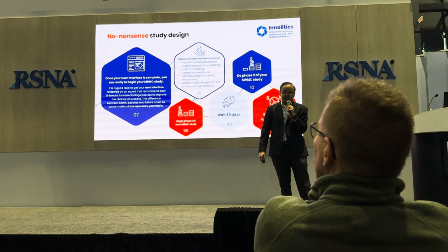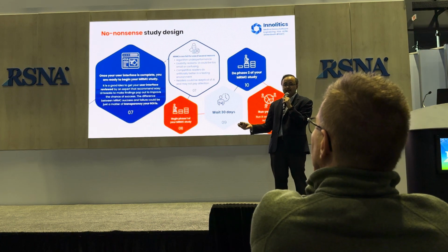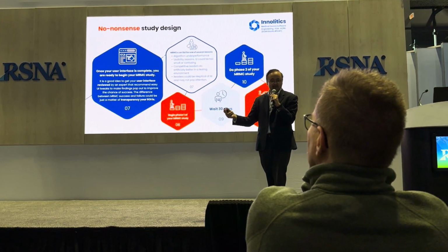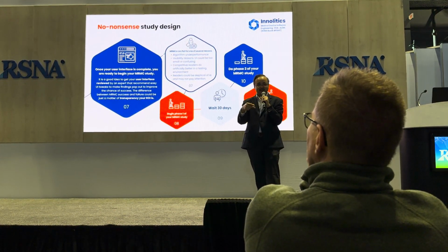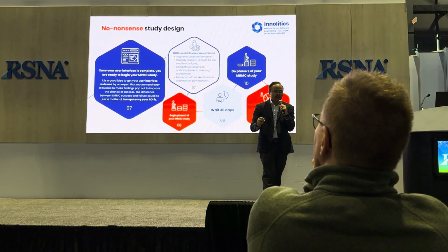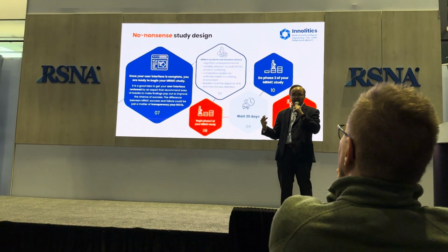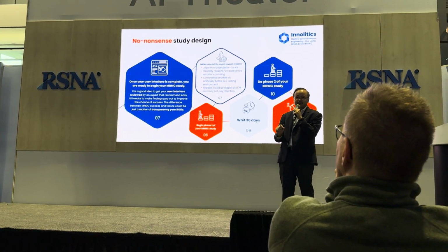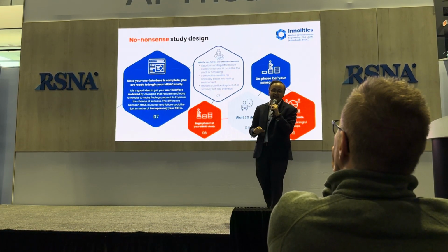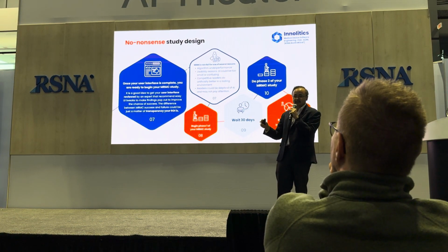A multi-reader study could fail for one of several reasons. The first reason: your algorithm just might not perform that well. If you did your standalone performance testing first, you would be able to find that out before doing the multi-reader study. If standalone performance testing doesn't work well, your multi-reader study won't work well either. Also, there could be subtle tweaks to your UI that could really improve the multi-reader study. Perhaps your tumors are too transparent, or small lesions are really difficult to see, so you might want to put an arrow there instead of just a little dot. In things like that, you would see a high standalone performance test but a low multi-reader study output.